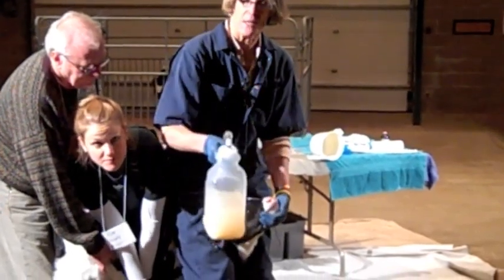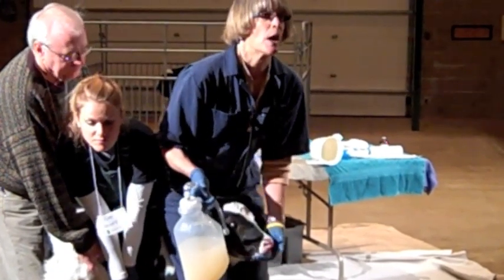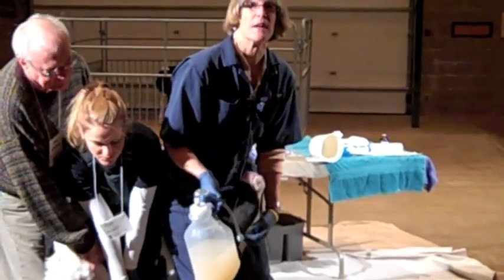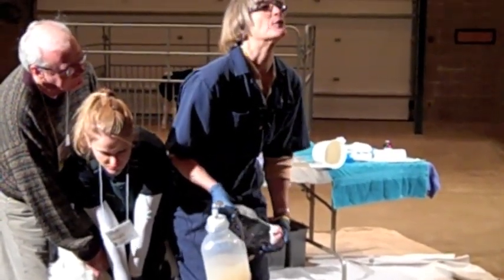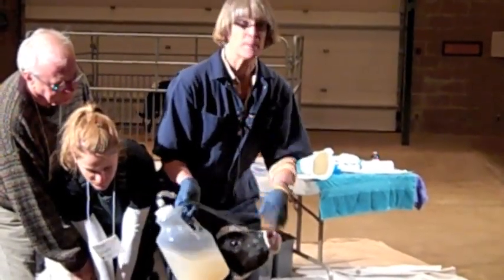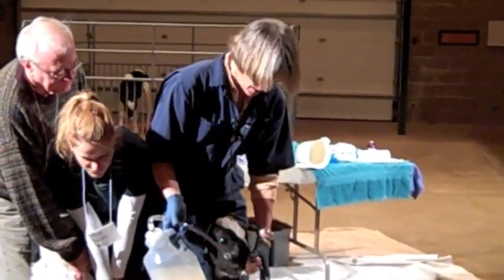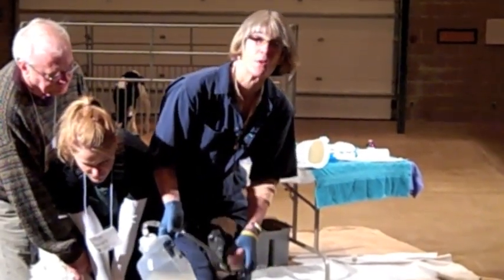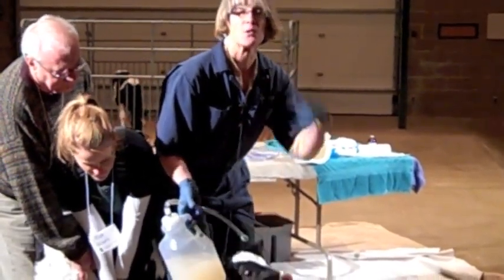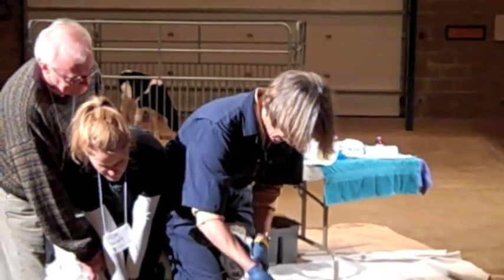How many of you have seen calves that came with an esophageal feeder to get their colostrum, and on day two their heads are out like this — you think they have respiratory disease, but they have a terribly sore throat from the trauma? One way to prevent that, during passage — cow or calf — is keep the nose below the ears. That means the tube is going to follow the path of the tongue, hit the back of the tongue where there's a ridge, and the calf should swallow.